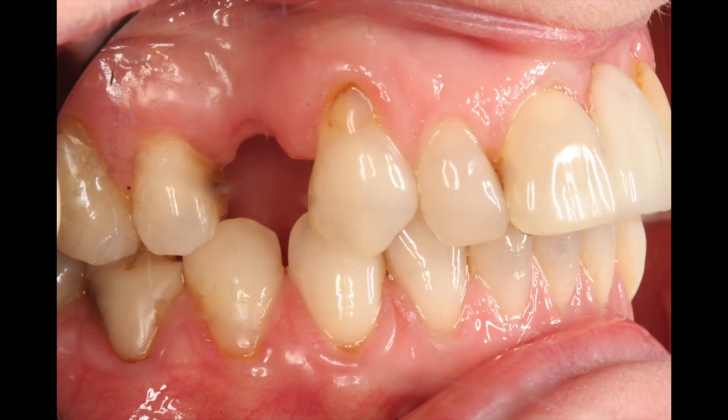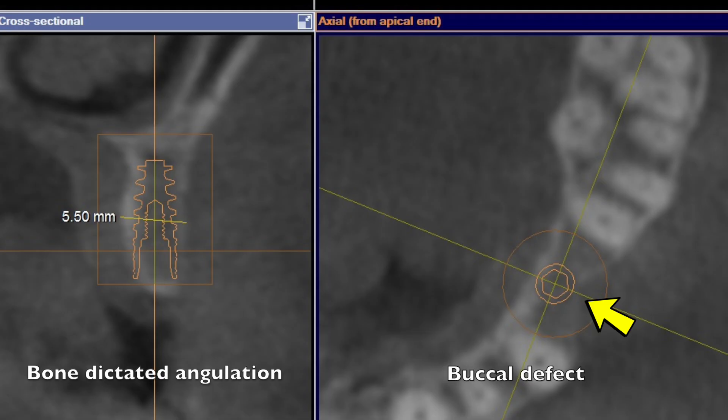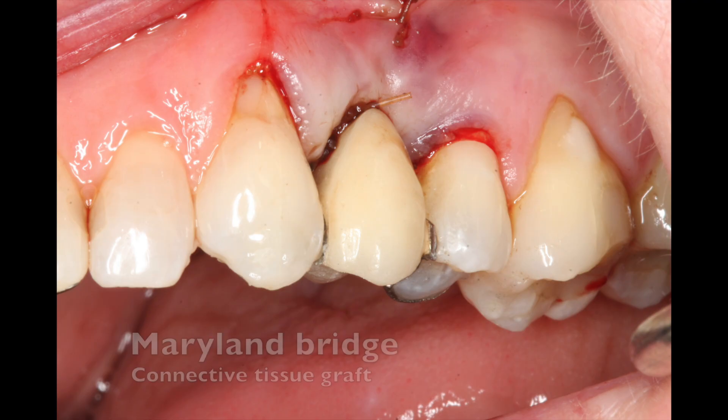I'd like to share a case that shows the ASC abutment in action. A patient came about four years ago with a Maryland bridge that was coming in and out of their mouth, and so they decided to have a dental implant. The bone had a defect here — very thin bone — which was going to dictate the angulation of the implant.